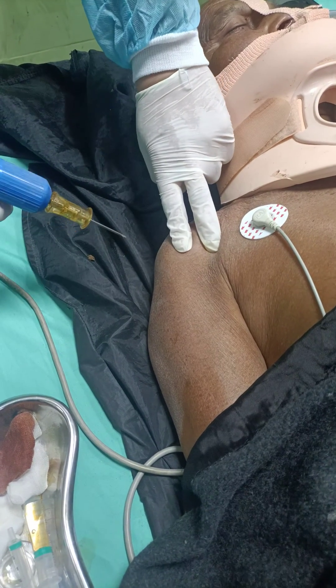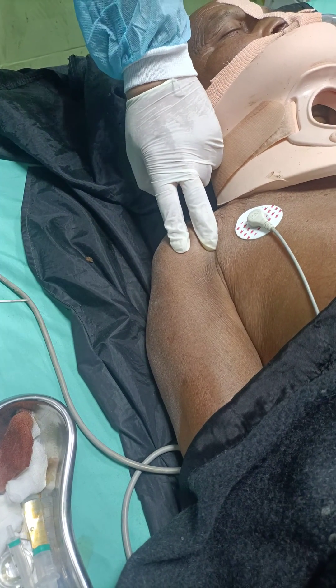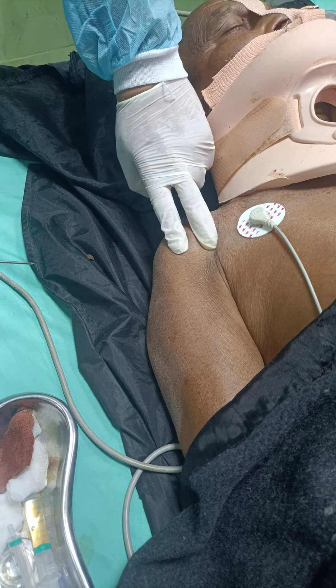Patient with difficult vascular access is going for humeral IO access using the two-finger technique.